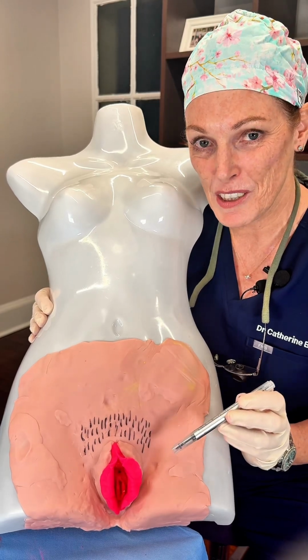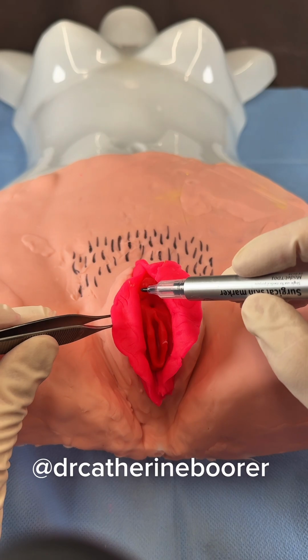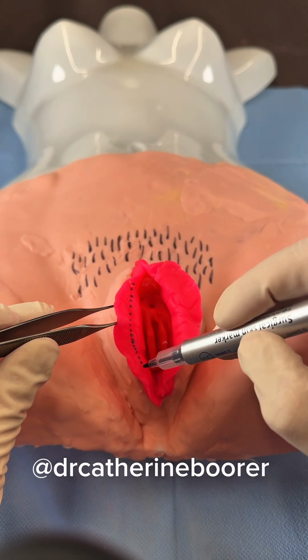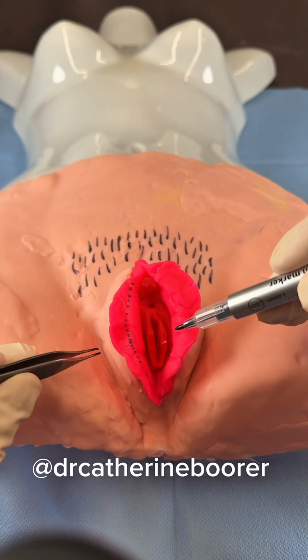Have you ever wondered how plastic surgeons perform labiaplasty surgery? So with this labiaplasty, I'm going to reduce the labia minora. It's common when you have labia minora that are too long that they can be really uncomfortable if they protrude beyond the length of the labia majora, which are the outside labia here.